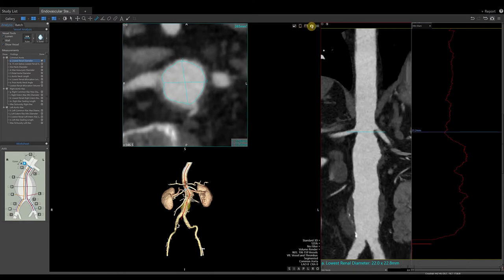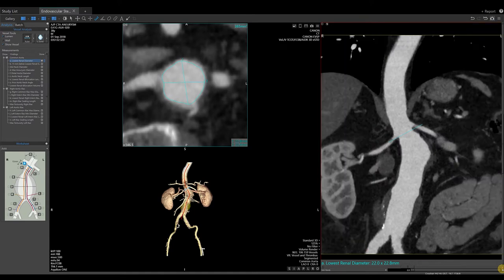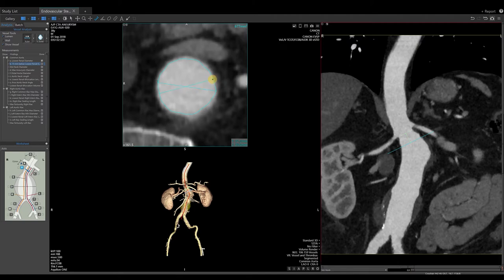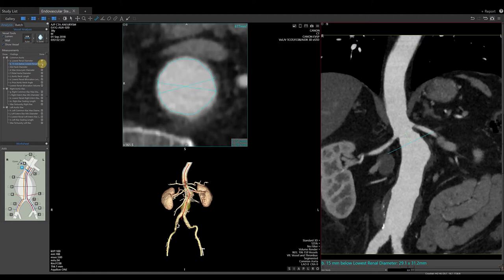Take a snapshot to save your progress. To return to our original CPR view, in the lower right-hand corner, select the red slash twice. On our work list, select the next measurement, 15 millimeters below lowest renal diameter. The software automatically places a light blue bar at the location and provides a length measurement, giving the 15 millimeter length at the bottom of the CPR image with the diameters from our cross-axial slice. If you disagree with the placement of these lines, hover over any endpoint on the diameter lines, left-click and drag to the new location. Once satisfied with the measurement, check the box to save and lock that measurement in place.